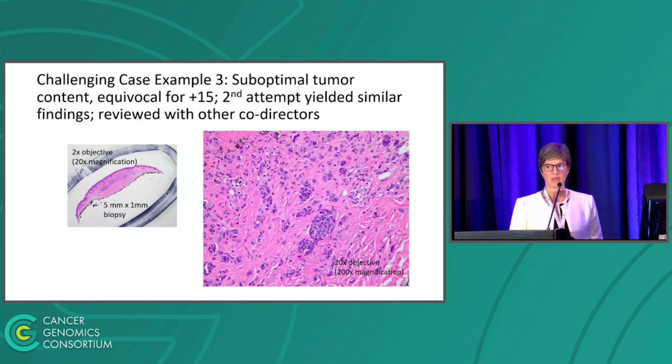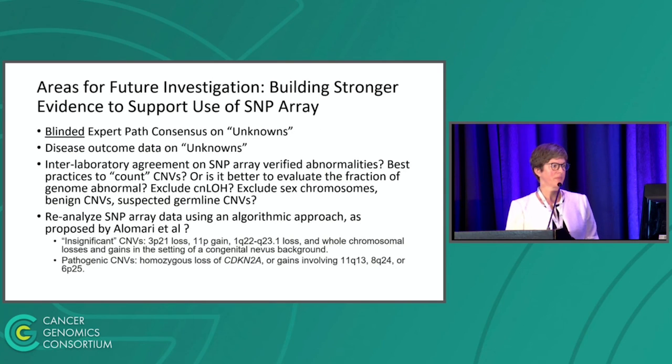And so basically what we're trying to find when we do the tumor array is the dominant clone, because that's kind of also a harbinger of malignancy, whereas I think early on there are probably multiple evolving clones until it reaches malignancy. So not really sure at all, but again, this highlights the need to have conservative thresholds for tumor content to make sure that we're adequately detecting abnormalities, and also to remember that we may occasionally have subclones. And so I have run out of time, but just wanted to highlight some of the areas that we could work on as a scientific community.